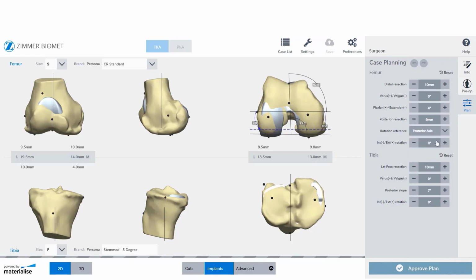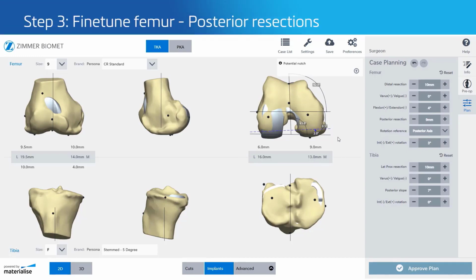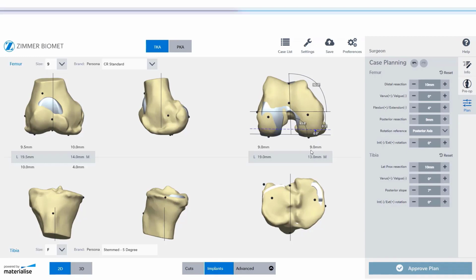Switch to the posterior axis and visually assess how well the rotation aligns with the patient's posterior condyles. If you like to follow a resurfacing methodology, you can move to the posterior reference axis with 0 degrees external rotation. Then assess posterior resection levels medially and laterally and fine-tune based upon your clinical judgment.